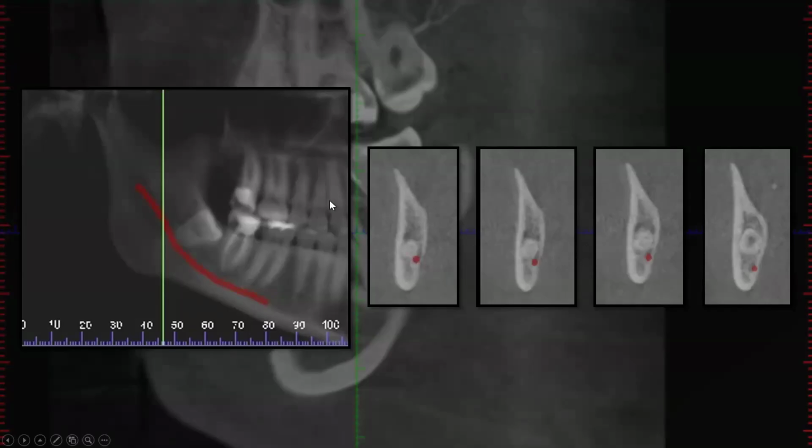So oral surgeons are going to look at these and determine risk versus reward. Sometimes if it's really intimately involved with the canal, they're going to just decoronate the tooth if they have to, or leave it. If it's not causing other problems, you can leave these teeth. But if you're worried about resorption or caries on the second molar, you can decoronate the tooth. And in most cases, patients do pretty well. Of course, there's risk of that getting infected and then still having to go in and get the root.